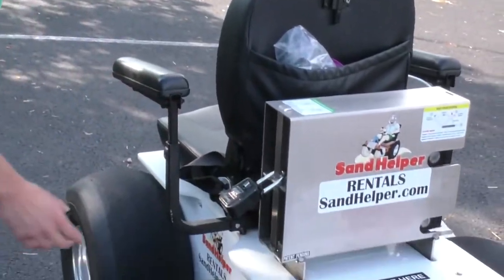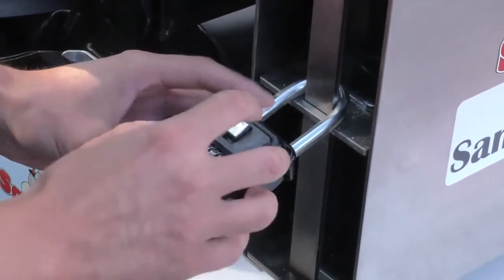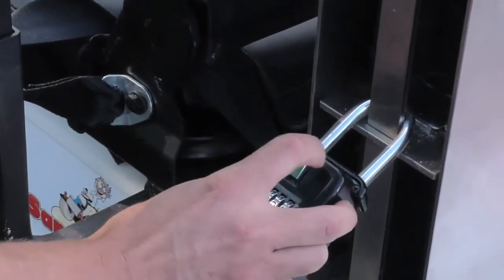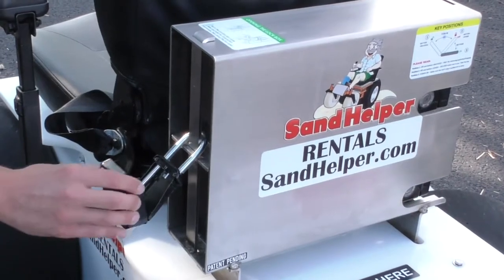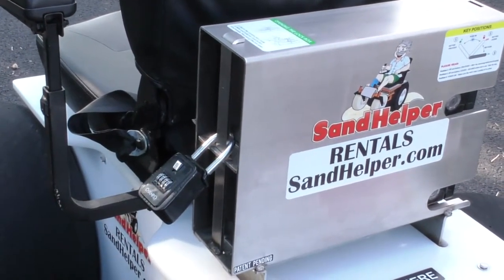The first thing you're going to want to do is get the key out of the lockbox. There is a lockbox attached to the back of the wheelchair, so you're going to dial the combination in, slide the silver button down, and it swings open. Get the key out, then close up the box and scramble the code while you're using the wheelchair.